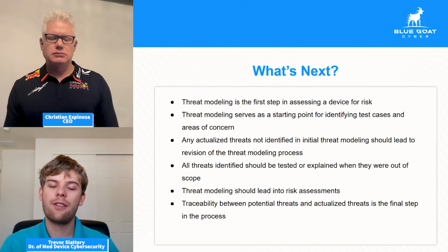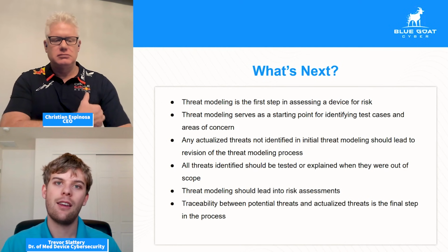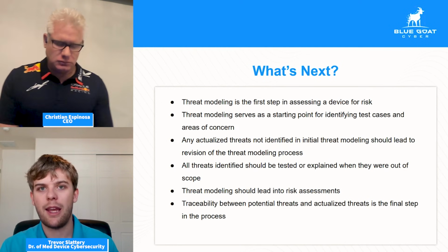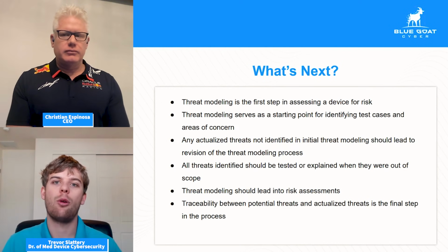Anything that we can test from a risk assessment penetration testing perspective should have a test case, should have that mapping back to the threat model. And anything not, we need to explain why there is no relevant test case as part of that penetration test and what we did instead.